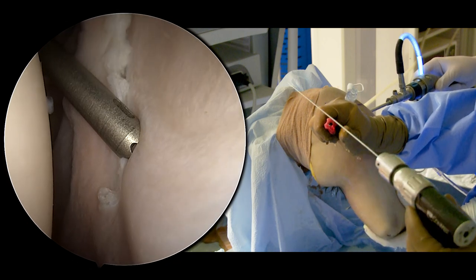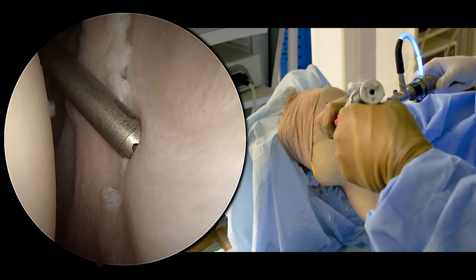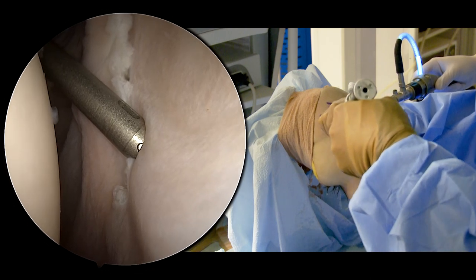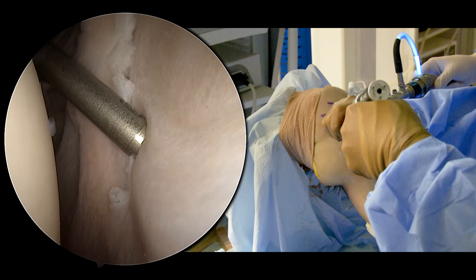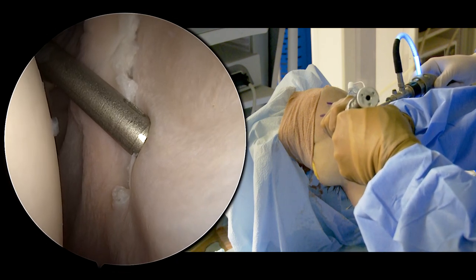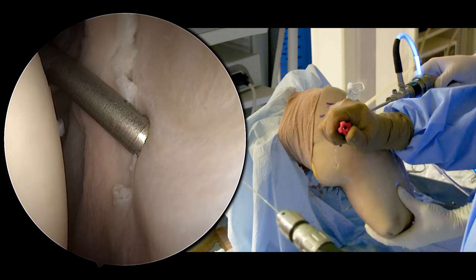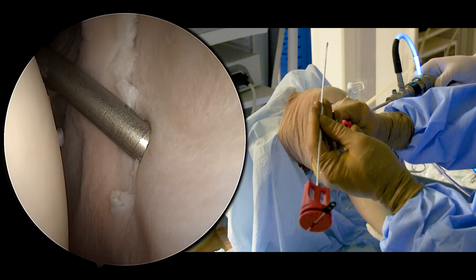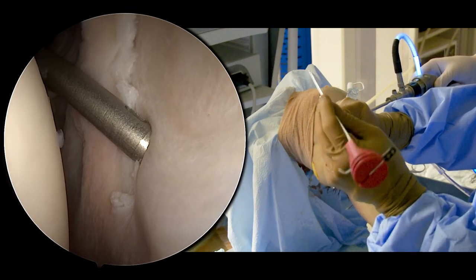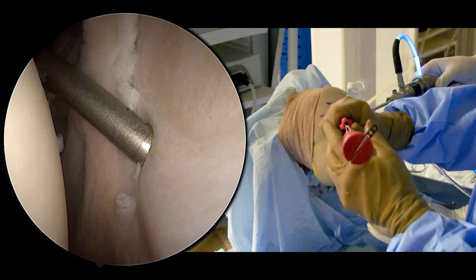Now we are going to drill for our anchor. This is a flexible drill, which allows us to get really low on the glenoid face and have a good trajectory. And then we have our 1.8 millimeter knotless fiber tack anchor. If you hold it a little bit towards the front, you can insert it a little bit easier.